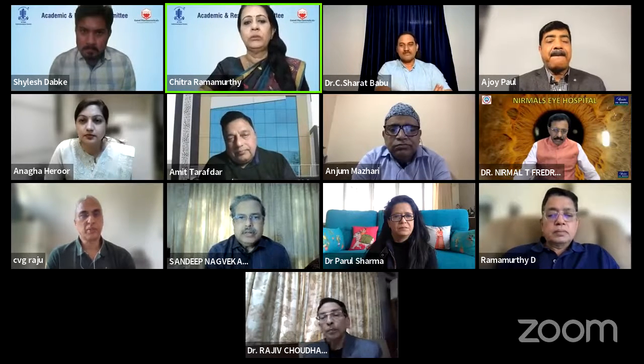Dr. Nagvekar wants to speak. Yes, Dr. Nagvekar. Yeah, I just wanted to make a comment that if I achieved consistency on my keratometry in all my pre-op evaluation, and if I knew that this astigmatism is more or less fixed, I would have definitely gone in for a toric lens. Obviously, this man with all this head nodding is very uncomfortable. He would be very uncomfortable to wear glasses. I think that's the reason why he asked for a multifocal.